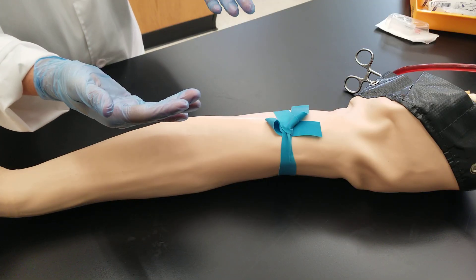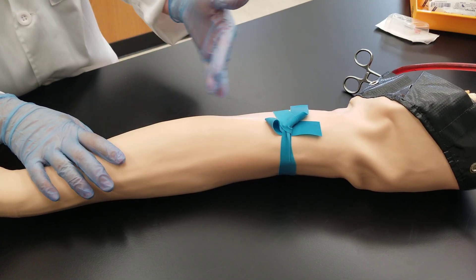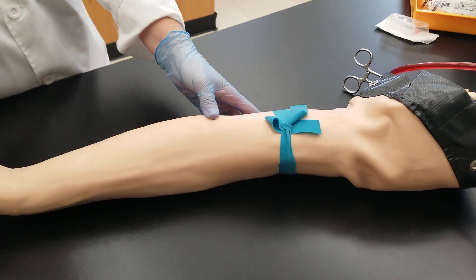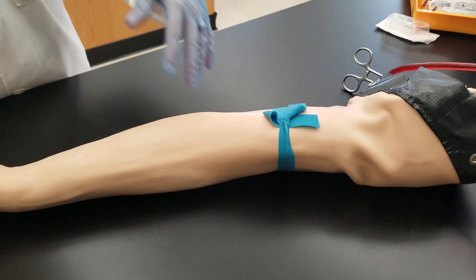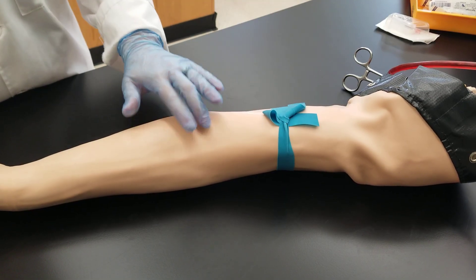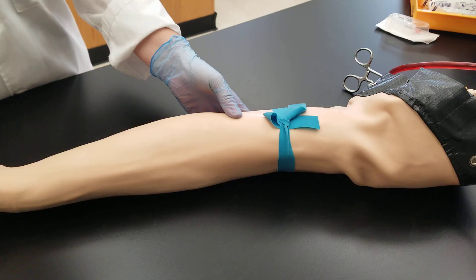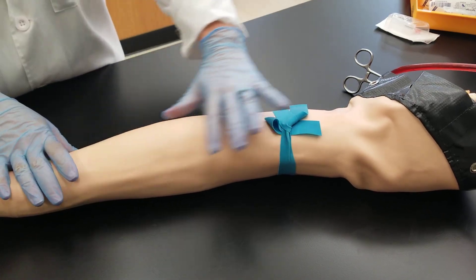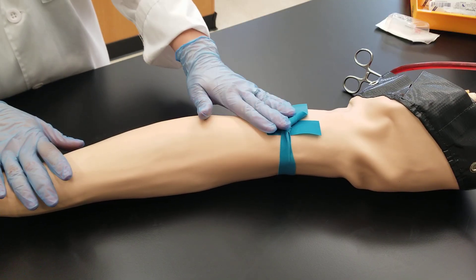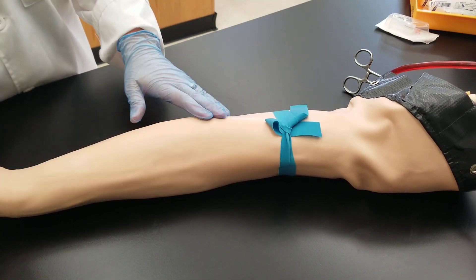Beautiful — that's what we're going to do. After you apply your tourniquet, you're going to feel for that draw site. You should have already assessed the arm before applying the tourniquet — first you talk to the patient and assess their arm, and when you put the tourniquet on, you're assessing the veins to feel where a good vein is: one that bounces back well, isn't hard, doesn't seem knotted, and the patient doesn't have any devices on their arm or a mastectomy on that side — which is a breast removal. There are many things to look for before you do this, but with the tourniquet on you can feel and see veins better.